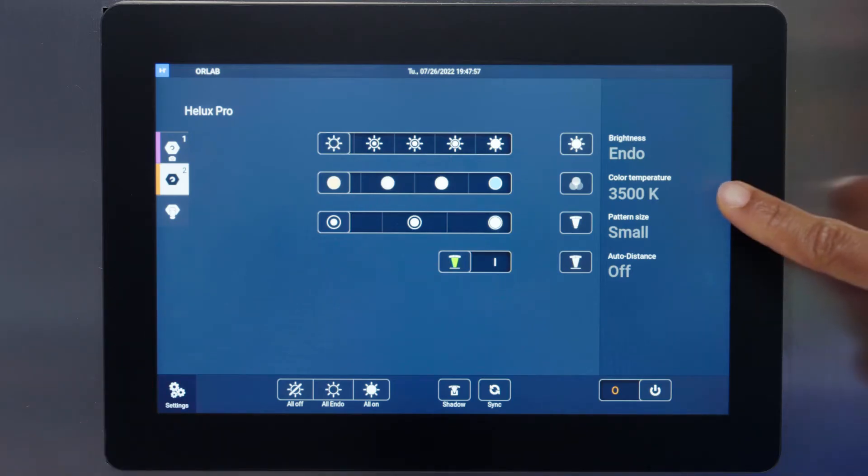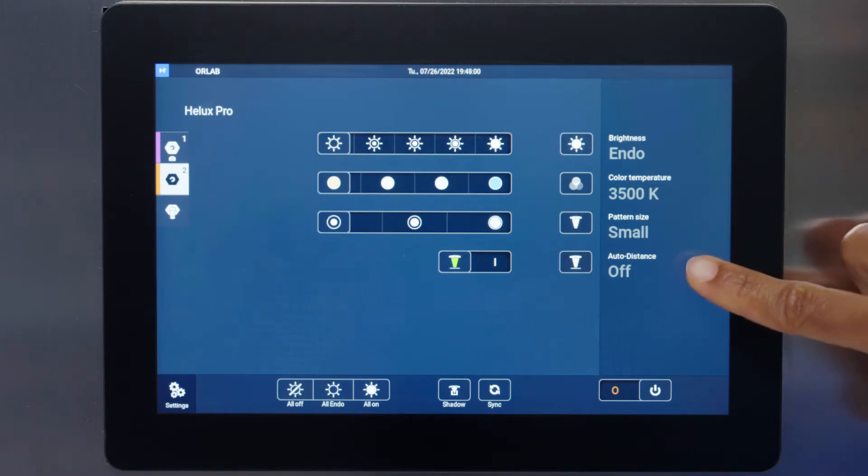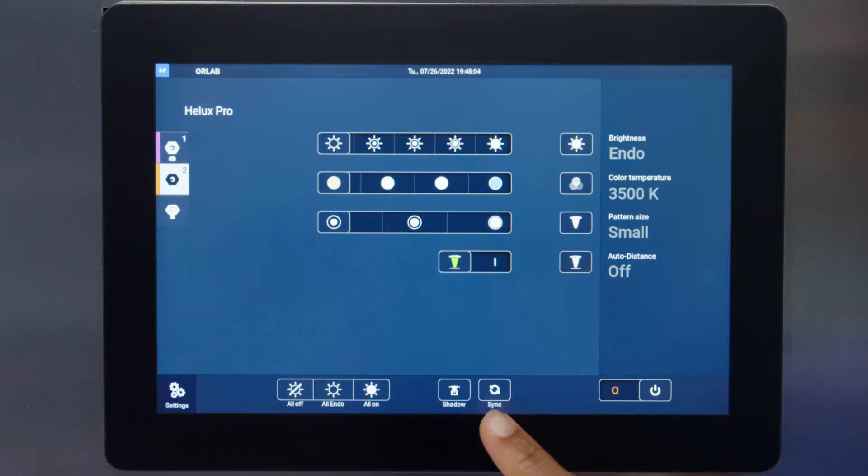Wall control features include brightness, light color temperature, and spot size controls; Auto Distance or ALC Plus on and off; power; a sync button; auto shadow; all on; all endo; all off; and finally settings to control the screen layout.